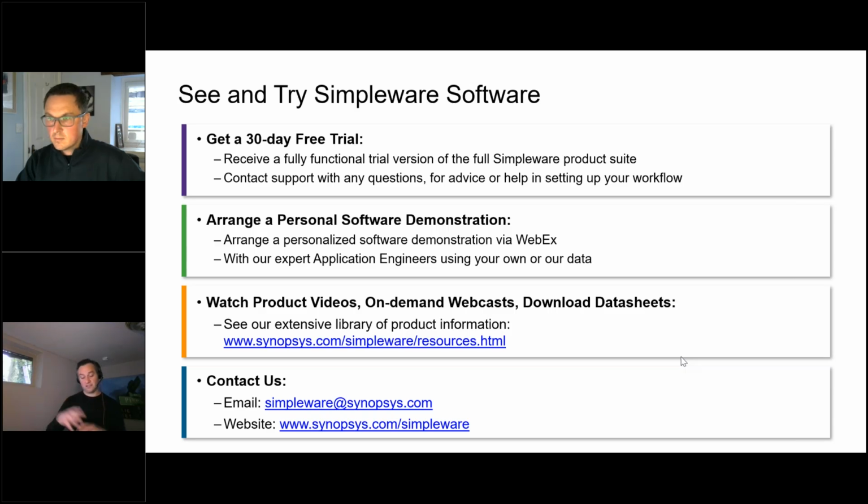There's an upfront cost to develop that, and we call that the DPP, or digital process packet. That's basically an executable that is dropped into Custom Modeler. So then from there, you license the software and you have your custom tool within that, and then you're off to the races from there. But yes, it's an upfront cost, and then you license the software from there.